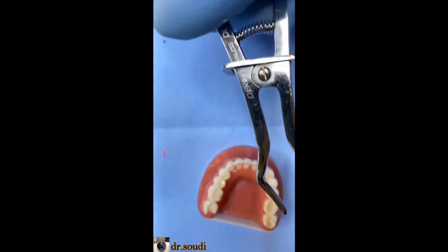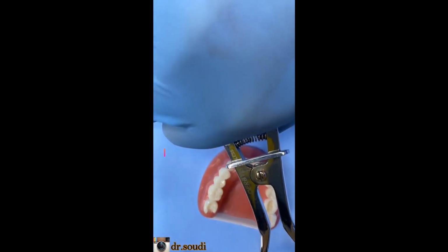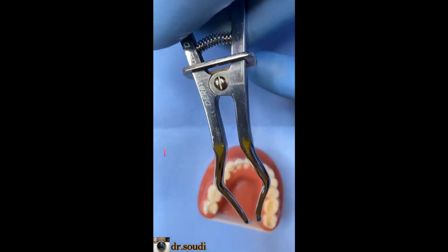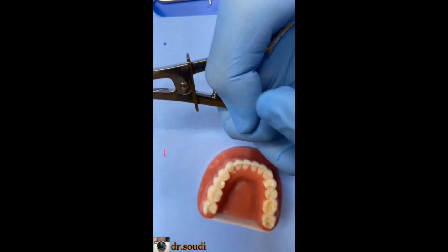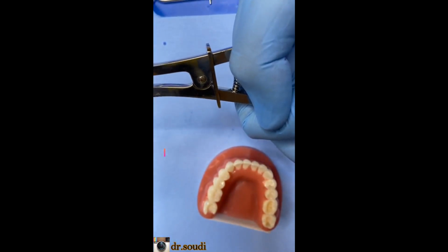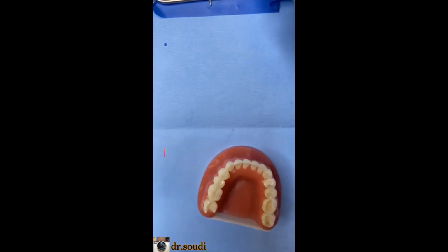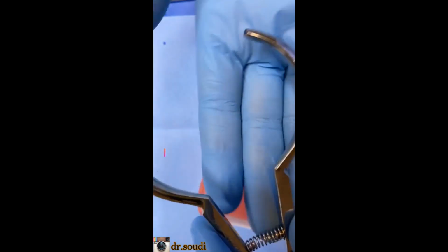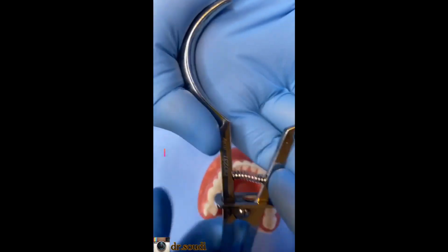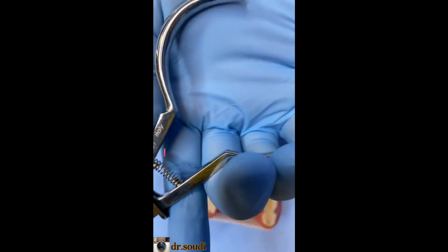Because when you have your clamp here and introduce it inside the patient's mouth, your finger can press on the patient's lips and teeth. You can hurt yourself or you can cause pain for the patient. So you need to see it clearly. So place it like this, like you do an extraction. You hold your forceps like this.